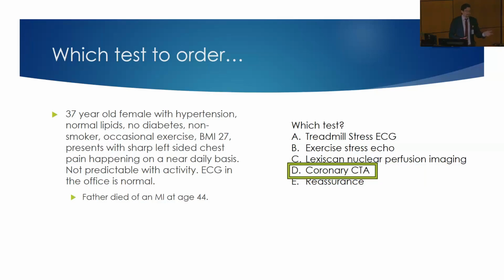Okay, so you need to have them exercising on the treadmill to get an accurate assessment of their workload, and it's also a more natural physiologic response. You get a more natural physiologic interpretation of what their cardiac function is doing. So you want to do Lexiscan or pharmacological studies only when they can't exercise.